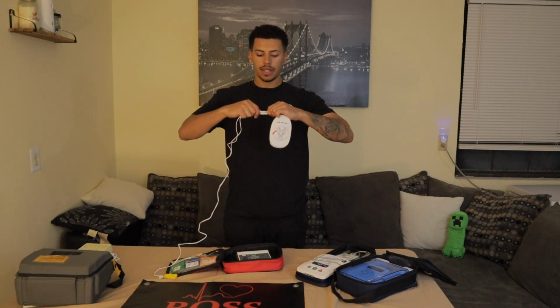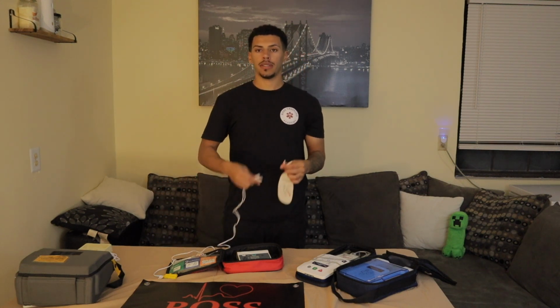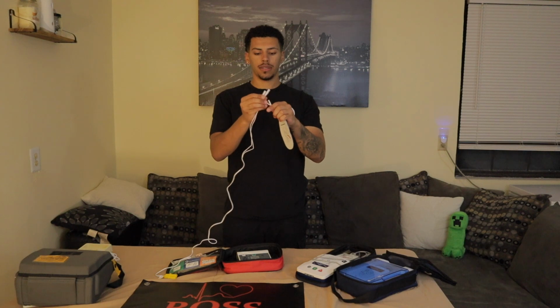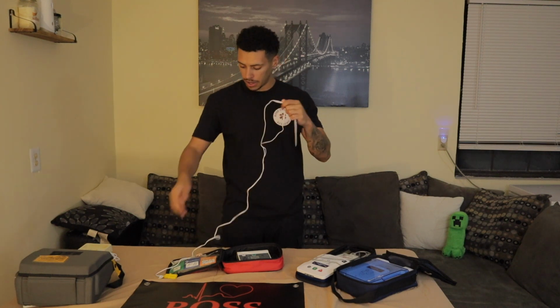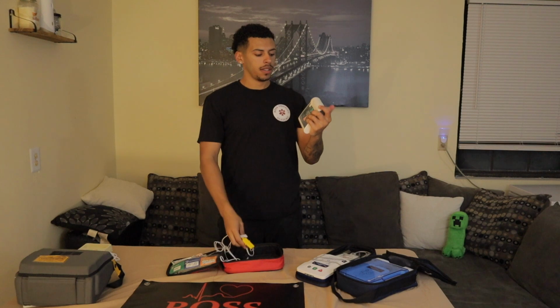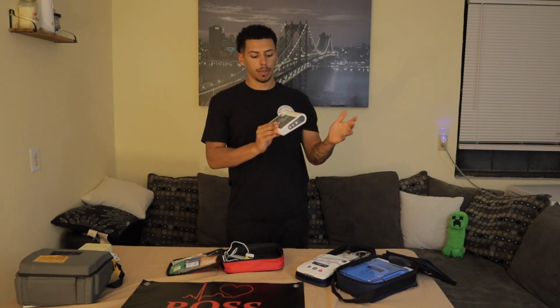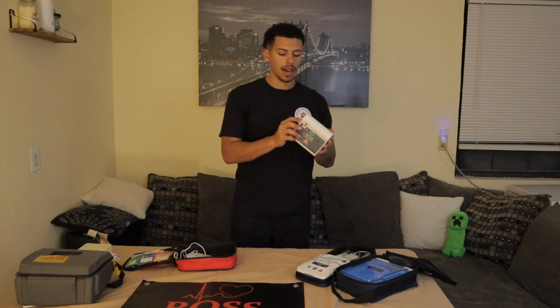The wires here connect in a very similar way that the mini AED connects. It just has two little connectors, and you plug it into the pads. And then we have this connector down here that plugs into the AED itself. The AED has only two buttons, just like most practice AEDs. And so now we're going to start having some more cool things going on with these AEDs.